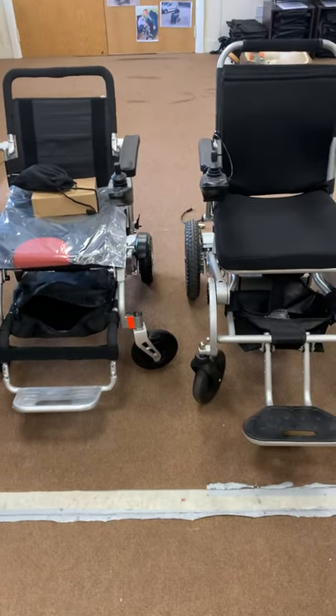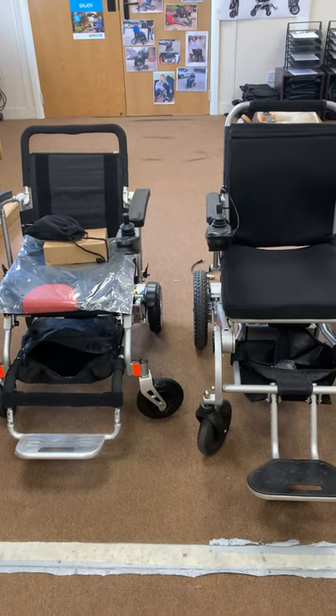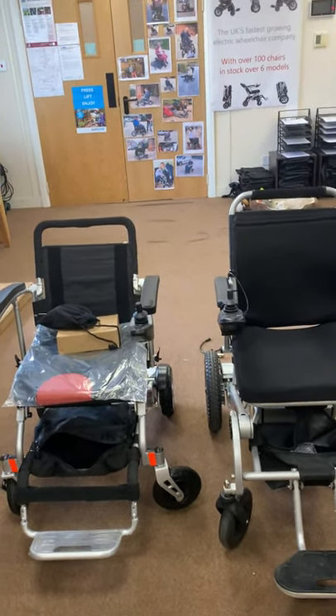It's kind of a story from Liftec Mobility. In today's video we're going to be talking about how to charge the Smart Chair X and the Liftec Compact Chair.